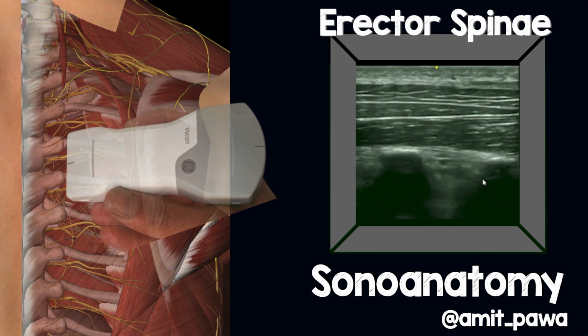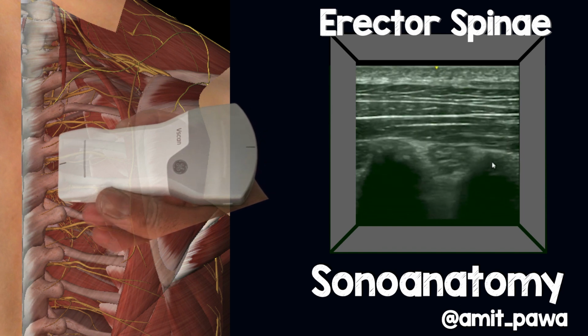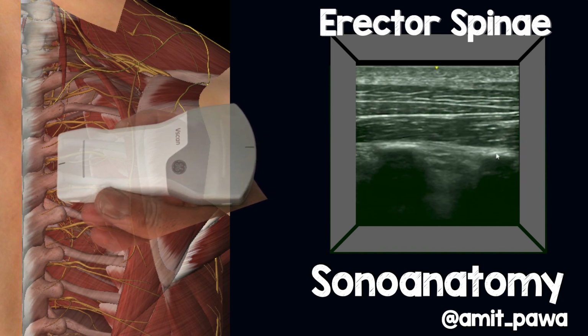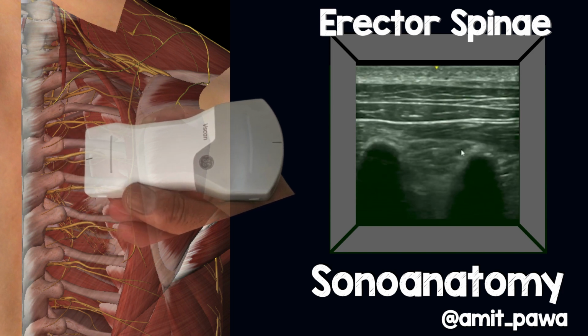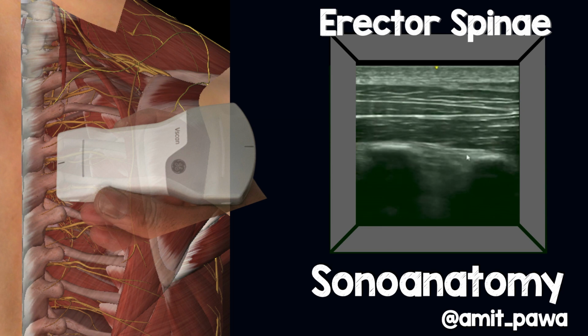As we slide towards the midline, the rib shadow changes until it gets much more rhomboid or much more rectangular. That's the transverse process. Going back to the ribs, you see they're curved, then go back to that transverse process, and you'll notice as we've gone towards the transverse process, that muscle bulk immediately above it gets thick and large.